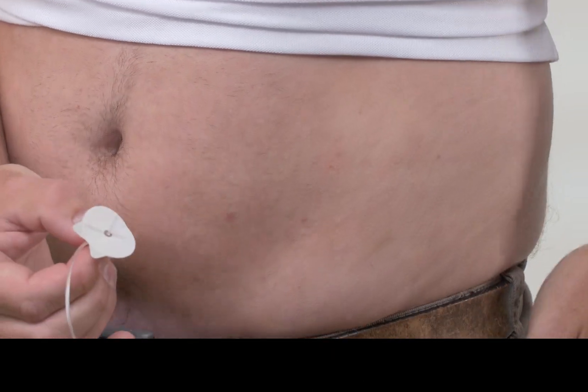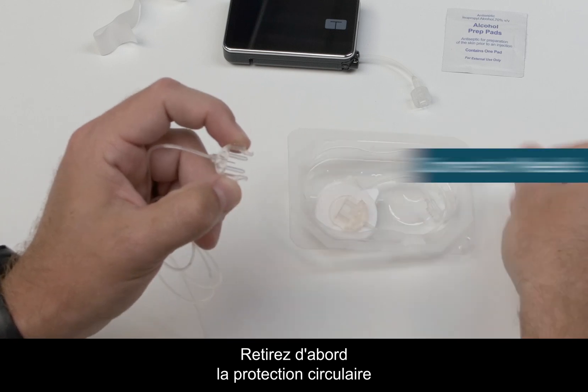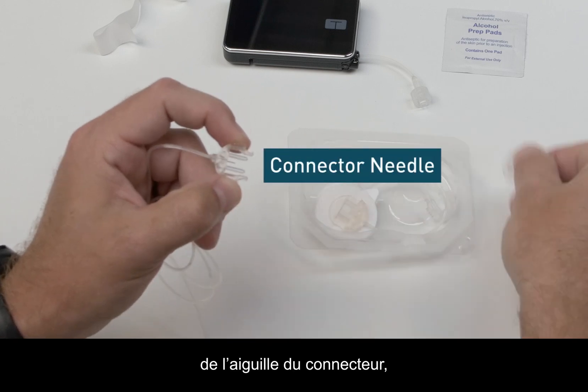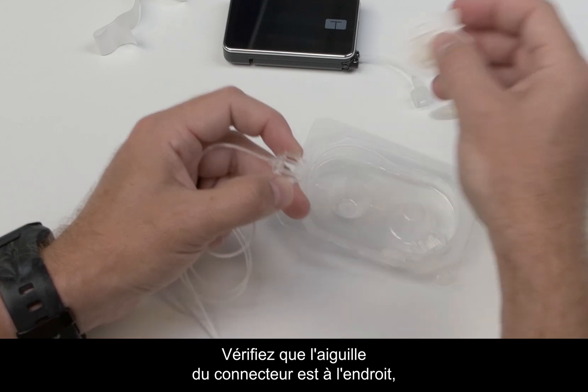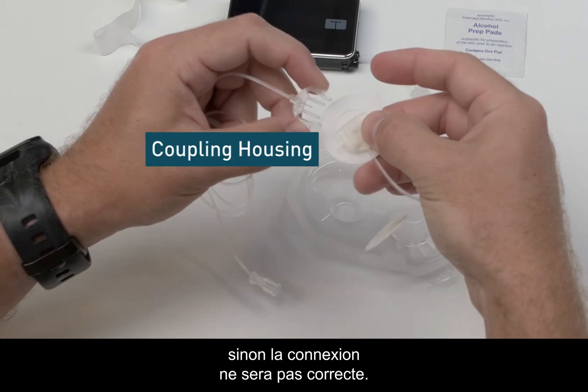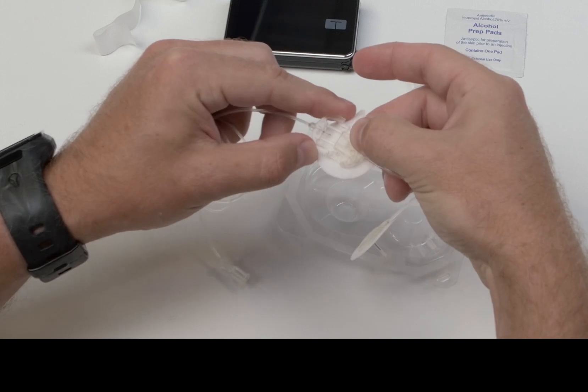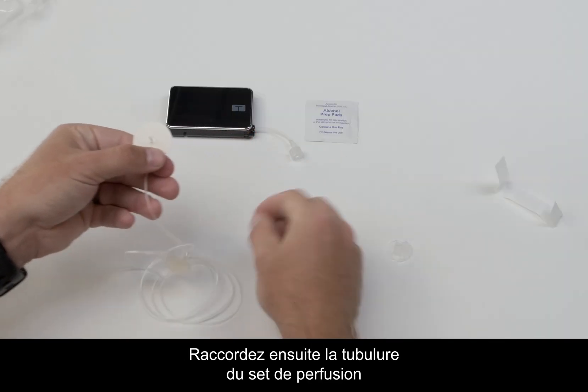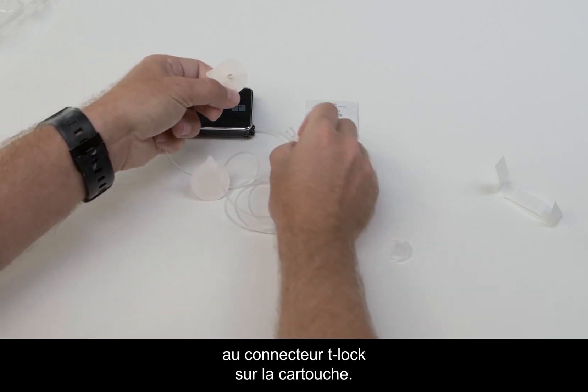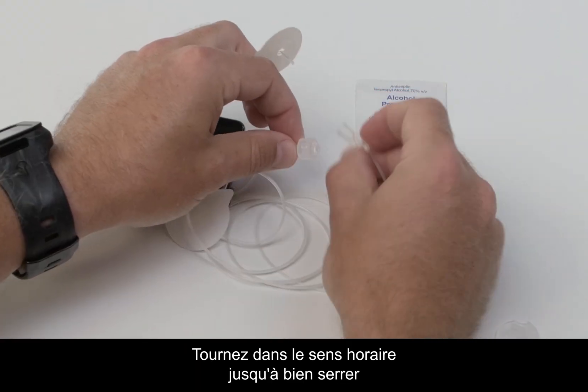First, remove the circular protective cap from the connector needle. Then connect the coupling housing to the tubing. Be sure you have the connector needle right side up, otherwise it will not connect properly. You should hear a click when it connects.